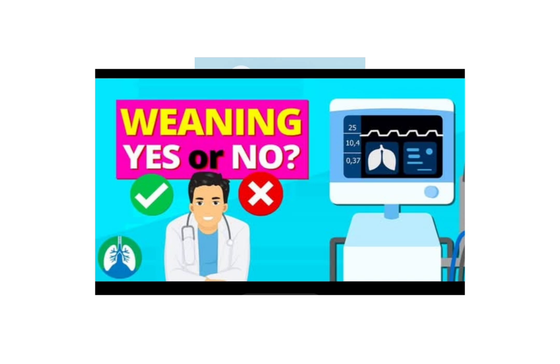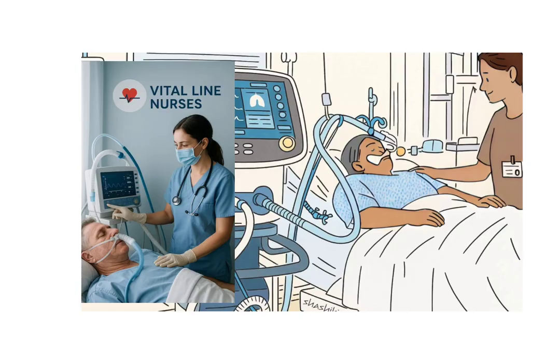Signs the patient is ready to wean. 1. Stable vitals. Heart rate, blood pressure, and oxygen saturation should be stable. 2. Good oxygenation. The patient should maintain good SpO2 on low FiO2 and low PEEP. 3. Alert and responsive. The patient should be awake enough to protect their airway and follow commands. 4. Breathing on their own. They should have an adequate respiratory rate and tidal volume with minimal support.